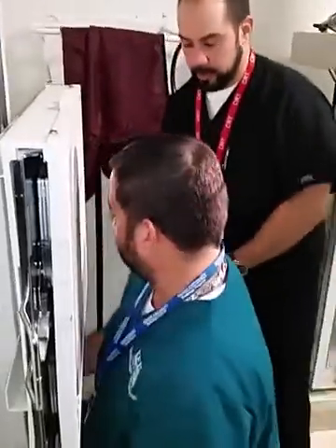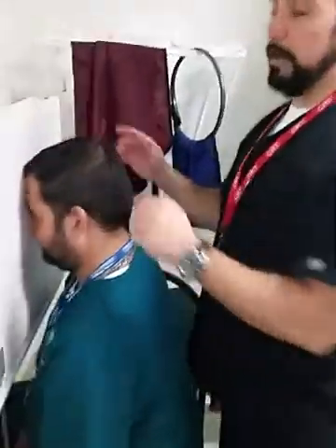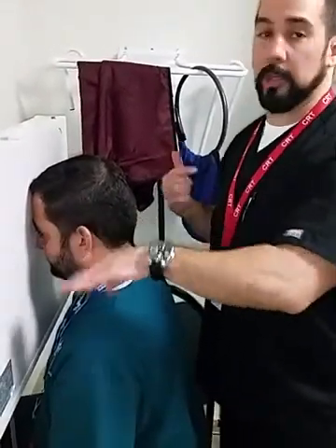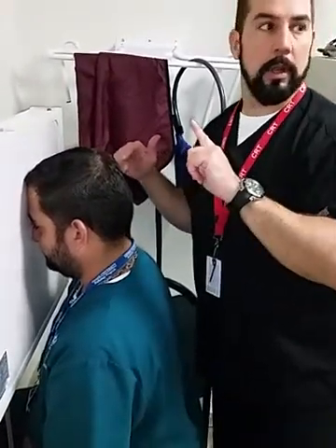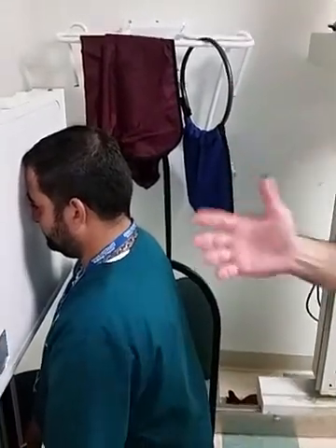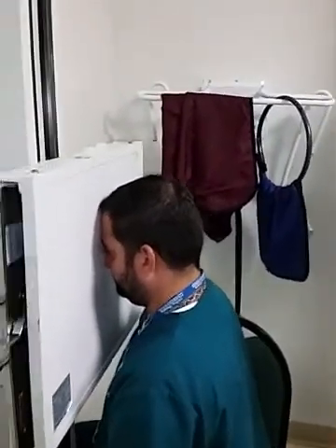All right, kind of get it lined up here. I'm going to have you slide over this way just a little bit. There we go. Perfect. Now see, here's one of those things I always tell you about. If you're looking at your patient directly from behind, I can see the mid-sagittal plane and see if he is tilted or rotated. From your position, I cannot see that. I can see his skull from the side, and I can see where the positioning lines are, but I can't see tilt and rotation. That's why I say you have to move around your patient, right? And so through the course of taking this exam, you should move to see the person from multiple different angles, so you can be sure if they're lined up correctly or not.